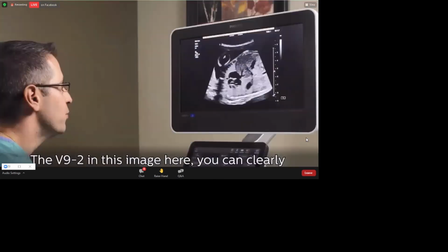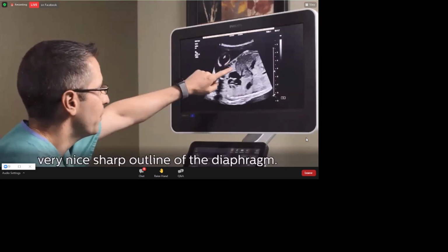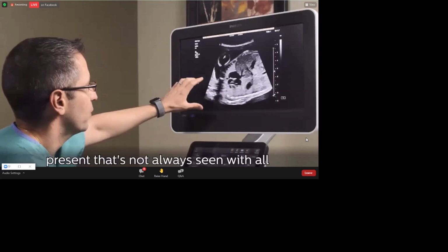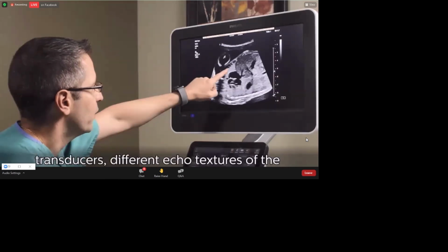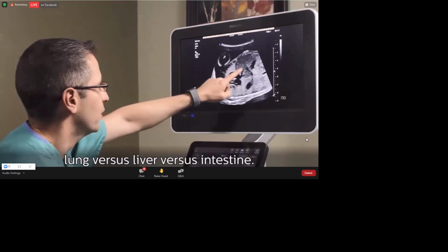The V92 in this image here, you can clearly see the fetal diaphragm present. You get a very nice sharp outline of the diaphragm. There's a very beautiful uniformity of tissue present that's not always seen with all transducers. Different echo textures of the lung versus liver versus intestine.